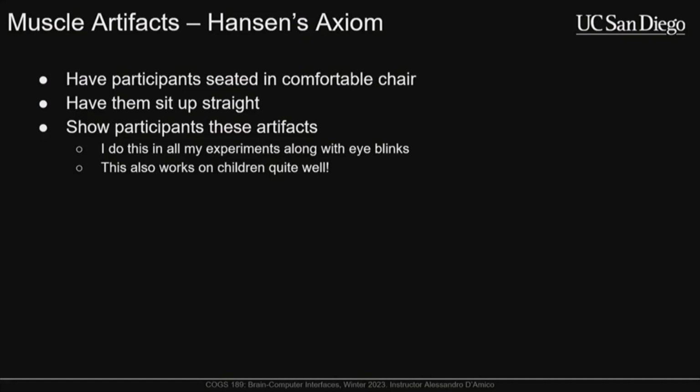But if you end up re-referencing to a signal like that that has noise, you will cancel out that channel from having that noise, because by definition, re-referencing is like getting rid of those channels. But you're now going to be adding that noise systematically to every single channel you're recording. So instead of doing that re-referencing approach, you would try to learn the signature of what these eye blinks or eye movements look like, and then use something like a regression-based approach to say, okay, this is the influence of this signal. Here are all my other signals. Let's subtract out the influence of this signal from all the other signals. Does that make sense? You're thinking in the right track. It's just don't re-reference, use regression instead.